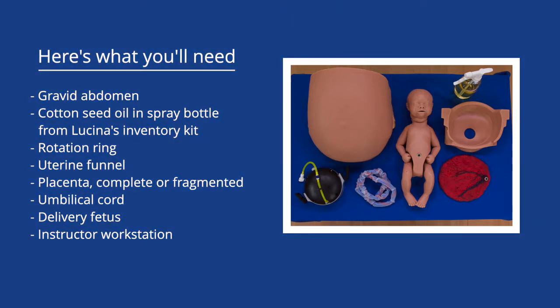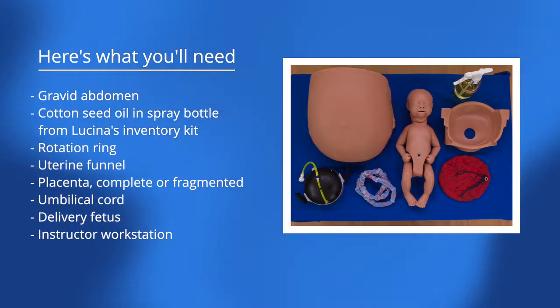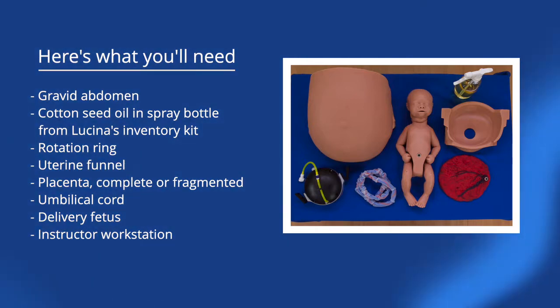Gravid abdomen. Cottonseed oil and spray bottle from Lucena's inventory kit. Rotation ring. Uterine funnel. Placenta, complete or fragmented. Umbilical cord.